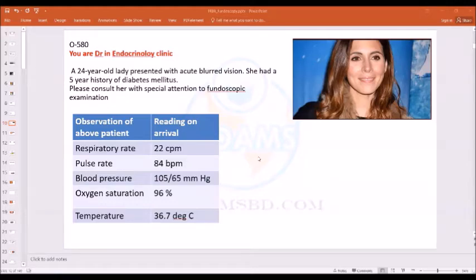Actually, there is nothing wrong in the visual field of the right eye. There is a central scotoma in the left eye. The right eye is normal. Okay. And now I'm seeing the ocular movement. Movement is not a problem, but when the patient moves the eye, the patient has more pain in the left eye. At the same time, I'm also looking for any nystagmus. Actually, nystagmus is very difficult to elicit here because the patient has pain, so the patient cannot move her eyes more and more.